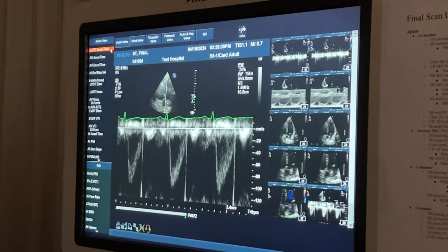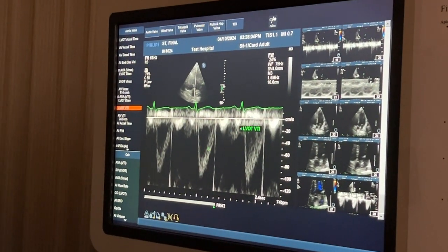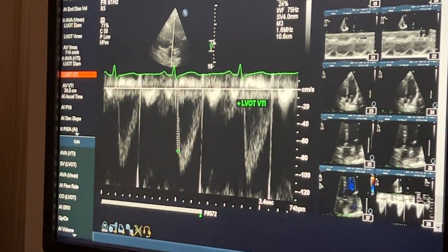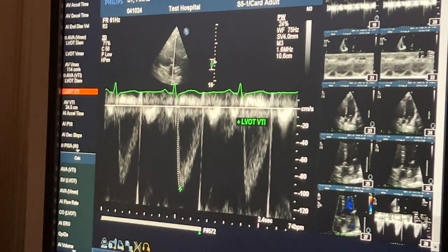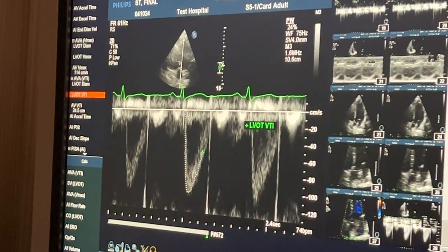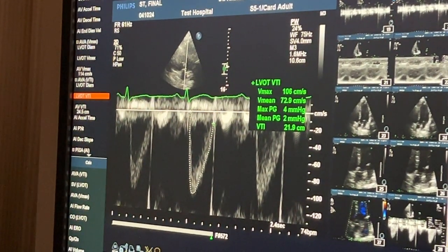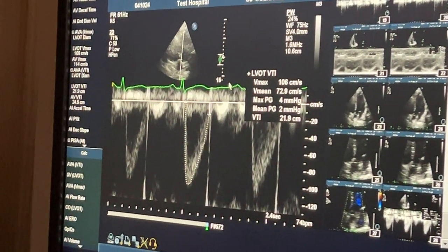Calc. It's going to now be your LVOT VTI, which lives right above this. It's in the same area. Aesthetic preference-wise, I try to center the one that I'm planning on measuring, just as long as my box is not in the way. It's very annoying. It happens all the time. You can move the box, but now I'm gonna click a kidney bean. Okay. I stopped there. Oh, it filled it.